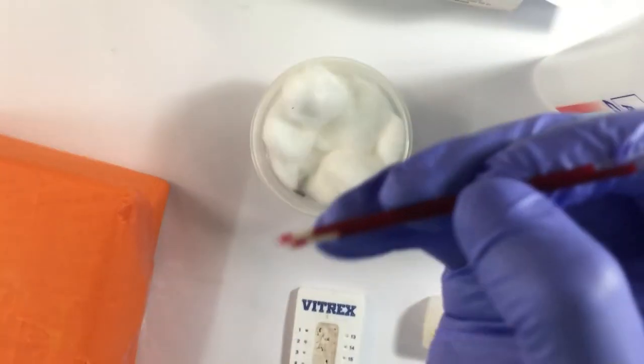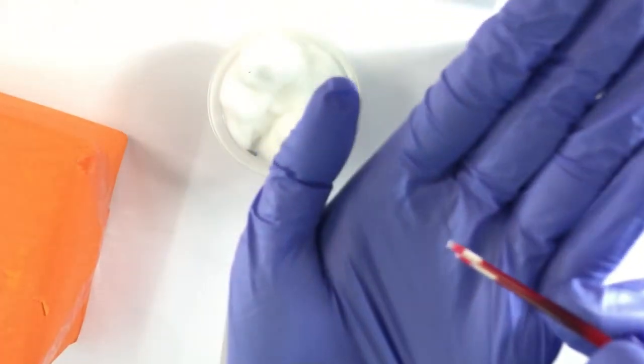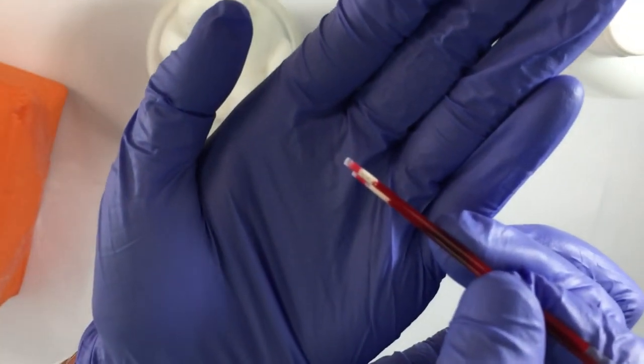So there you have it, the steps for blood collection through skin puncture. Thank you so much for watching.